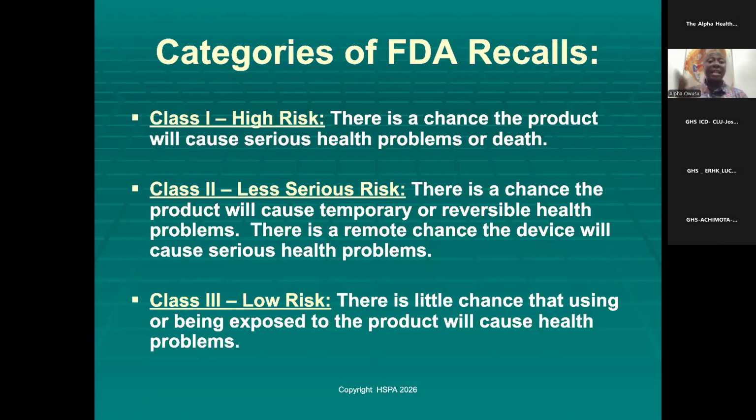But has there been even a time that somebody has brought a medical device from the States or donated? We don't even check how the machine is being used, whether it has passed its end of life or is obsolete, right? They brought it to us and we are happy and we start using it. It's very, very important that we look at all these things, because some of these machines, some of these instruments, are end of life. And when they bring it, we don't even sterilize them the proper way. It's very, very important, right?